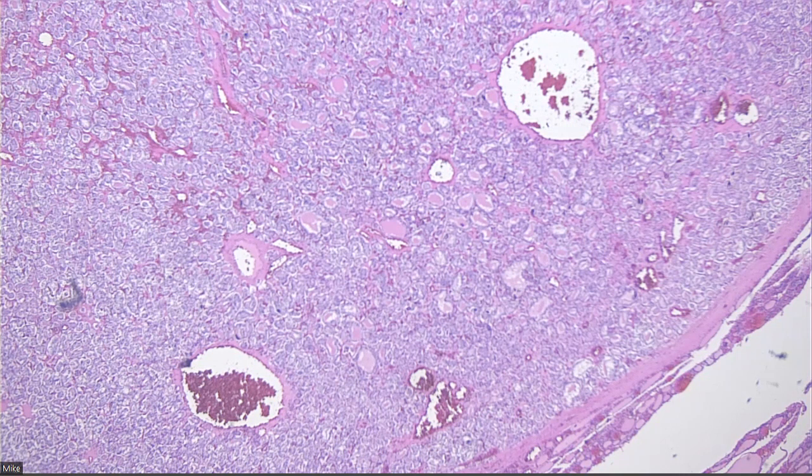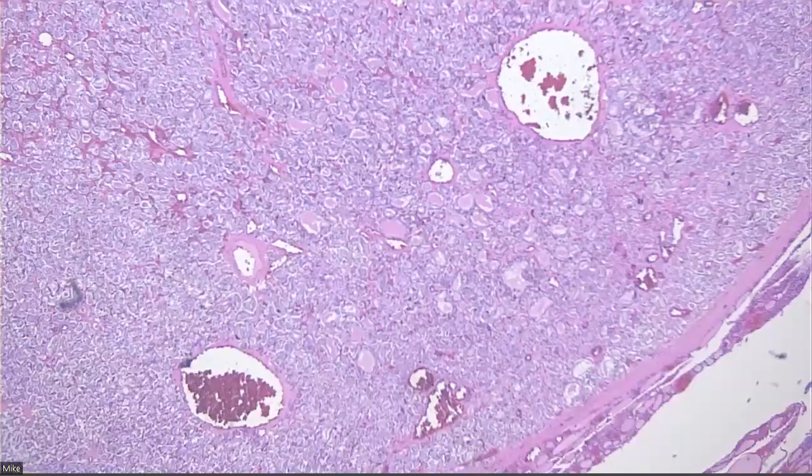But if they're going after something or multiple things, I will try to address all of them by commenting on each individually and correlating the FNA to the location in the thyroid gland, making sure that I am seeing what they thought they were seeing and addressing any potential discrepancies on FNA if applicable, right? I want to make sure that everybody's on the same page.